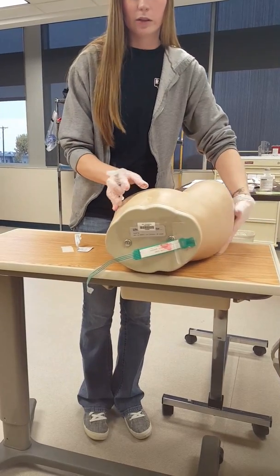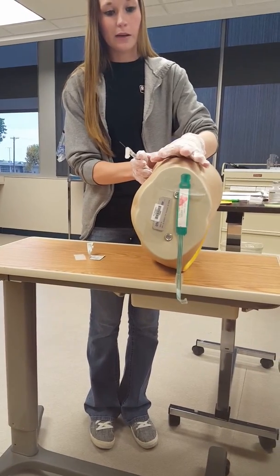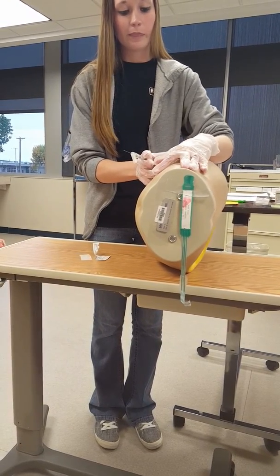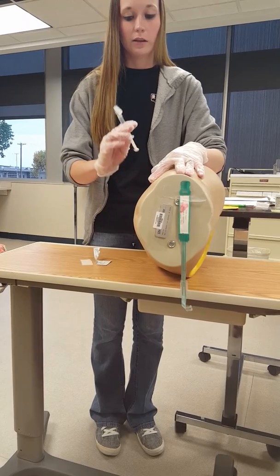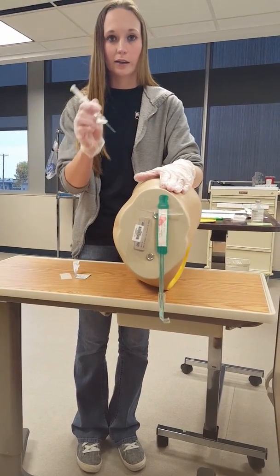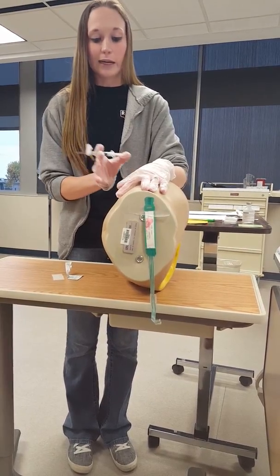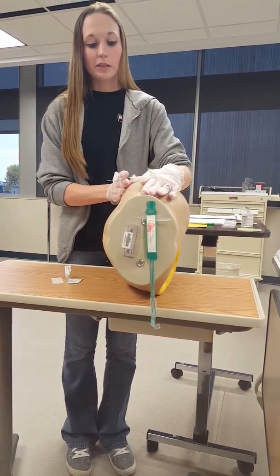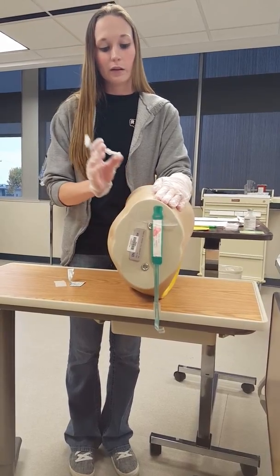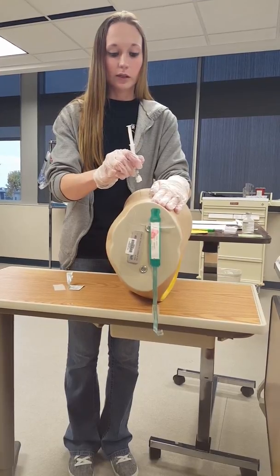If I touched it, I would clean it again. So I find my spot here. And then I would do a 90-degree angle, but first I would Z-track it. And then I would hold it, and then I would do the 90-degree angle and put it in.